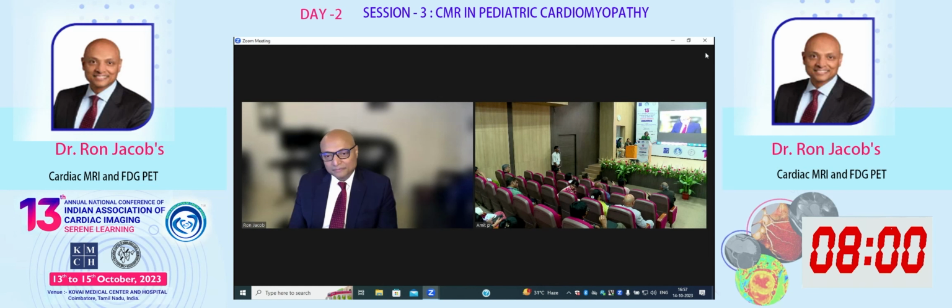And the phantom itself has a short shelf life, right? Yeah. So we need to know that phantoms, they are gels and water. Gels dry over time; they will change. It's like your reference gold standard yardstick changes over time. That's what you're doing.